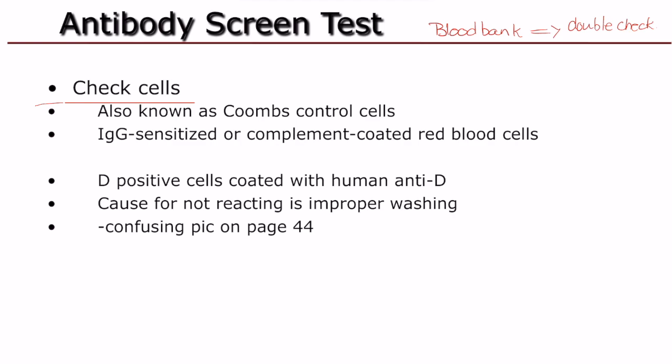And notice this says check. These cells actually have several different names. Check cells, you may hear Coombs control cells.